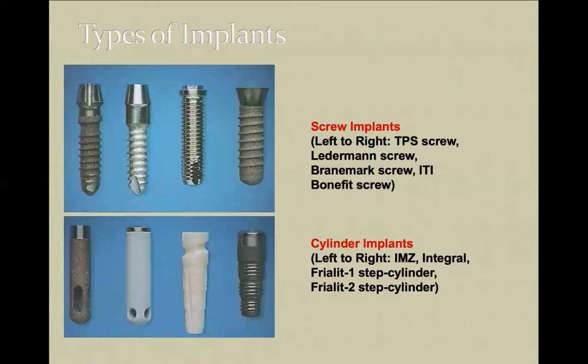Because once you expose the bone and you plan to place, like, a 3.75, 13 millimeters length implant, and you find the quality of the bone is not acceptable, you have to step into another diameter and length.